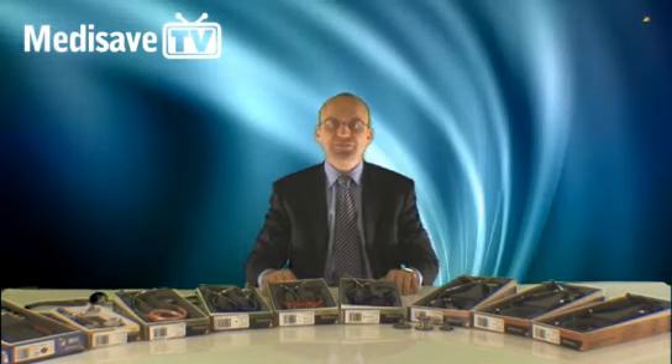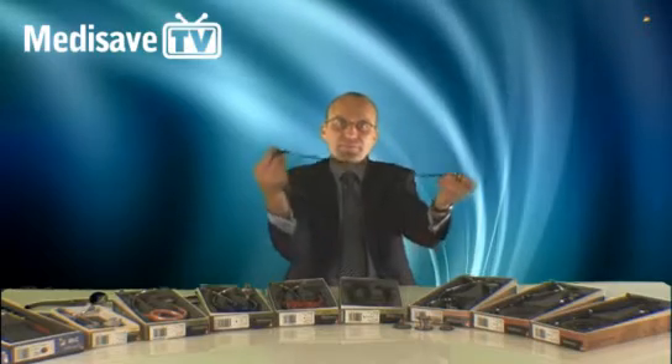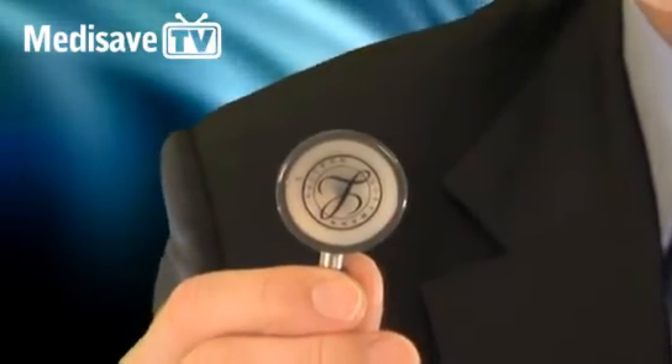Littman has designed two stethoscopes with the child specialist in mind. This is the paediatric stethoscope. It has a double-sided stainless steel chest piece, which means that there is a diaphragm for high-frequency sounds on one side, and on the other side for low-frequency sounds is the bell side.